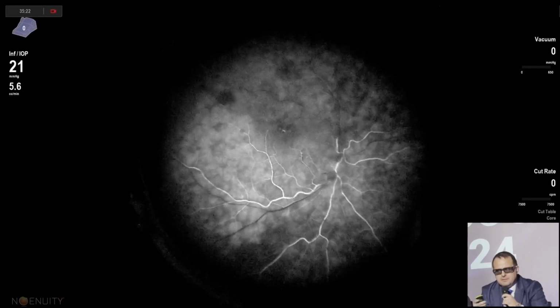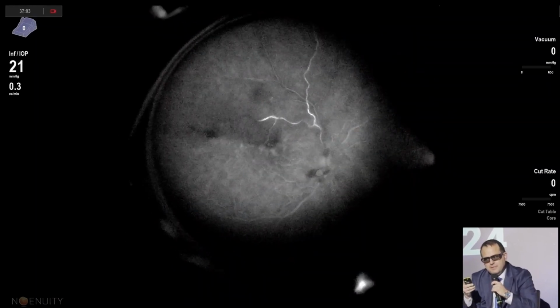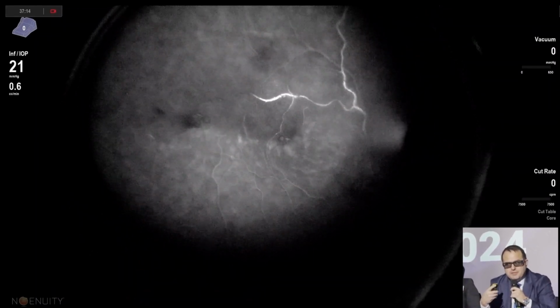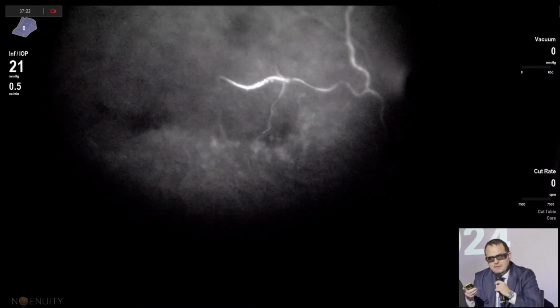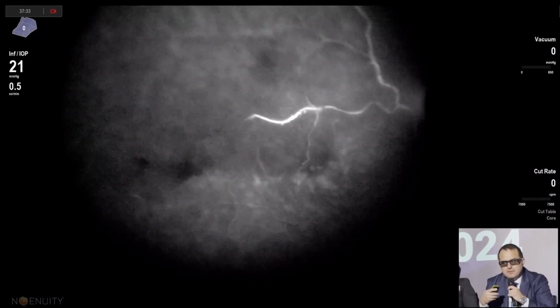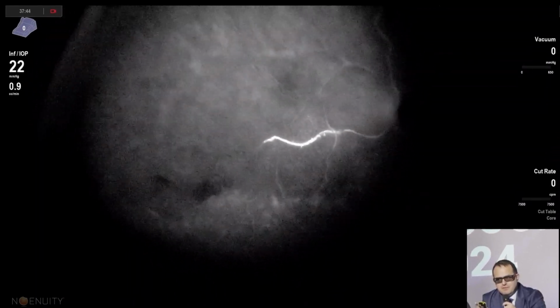So, last but not least, we have the ability to perform intraoperative fluorescein angiography with Ngenuity, and I want to stress your attention on the vessel of the upper arcade, which is a reperfusion. It was a case of arterial occlusion. It changed our approach because we used heparin on perfusor intravenously, and we show a reperfusion here. So these are phenomena which we don't normally see, or we are not used to see or look for during our surgeries. So you can follow the blood clots actually as a small white dots traveling through the vessel.